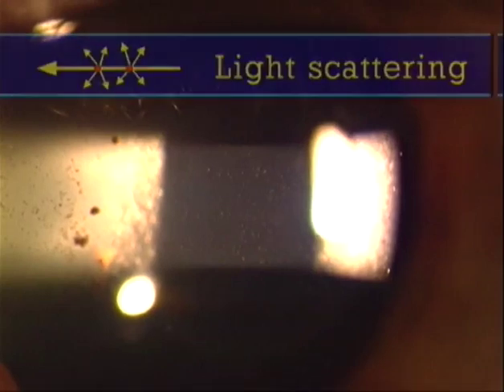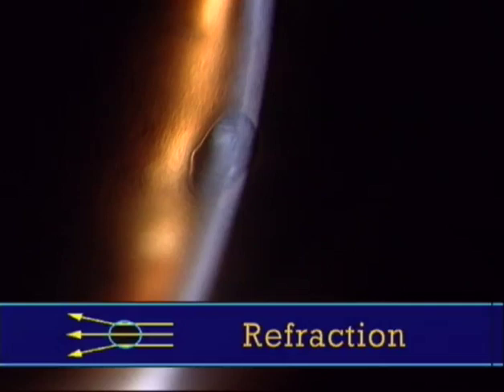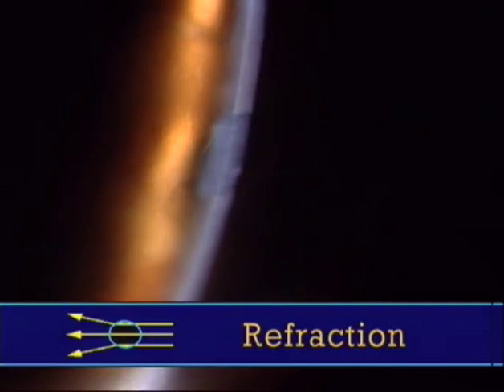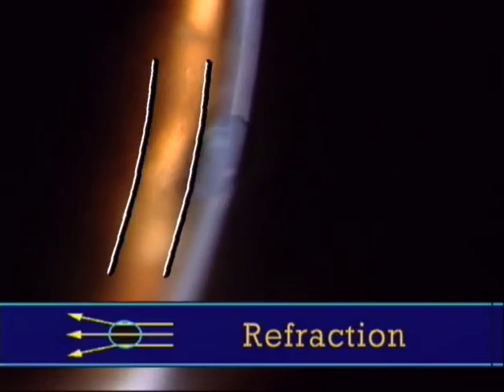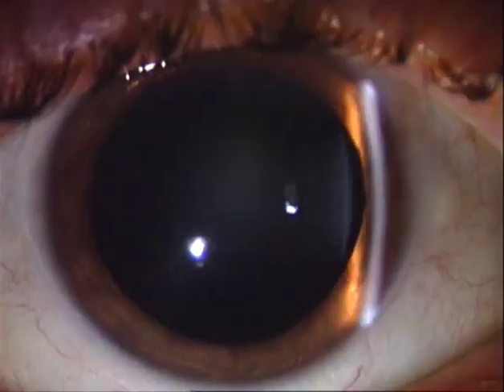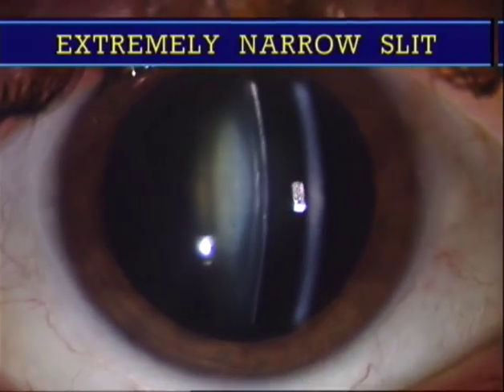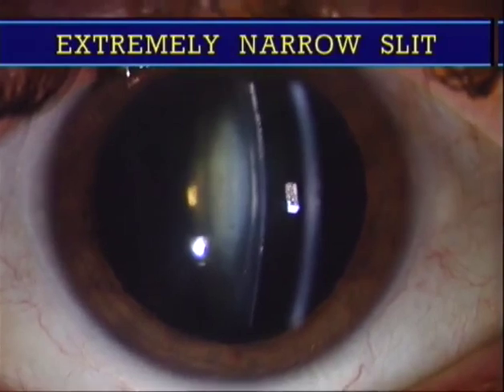When the margins of the light beam determine the quality of optical phenomena, the size of the beam should be reduced. For the detection of light scattering, the upper and lower margins are important, and therefore the beam is vertically shortened. On the other hand, for detecting refraction phenomena, the lateral margins are important, and therefore the beam is horizontally narrowed. A very special case is the extremely narrow slit beam, which is such an important feature that it has even given the slit lamp its name.